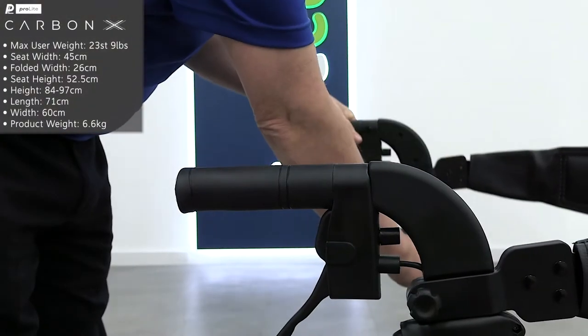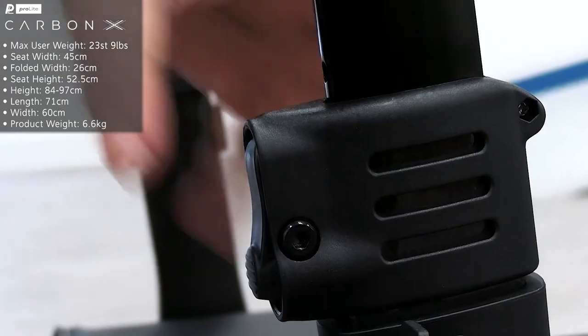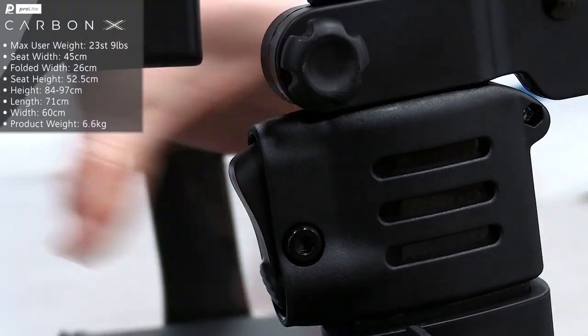The handlebar height can be adjusted between 83.5 and 92.5 centimetres using the tool-free push pin mechanism.